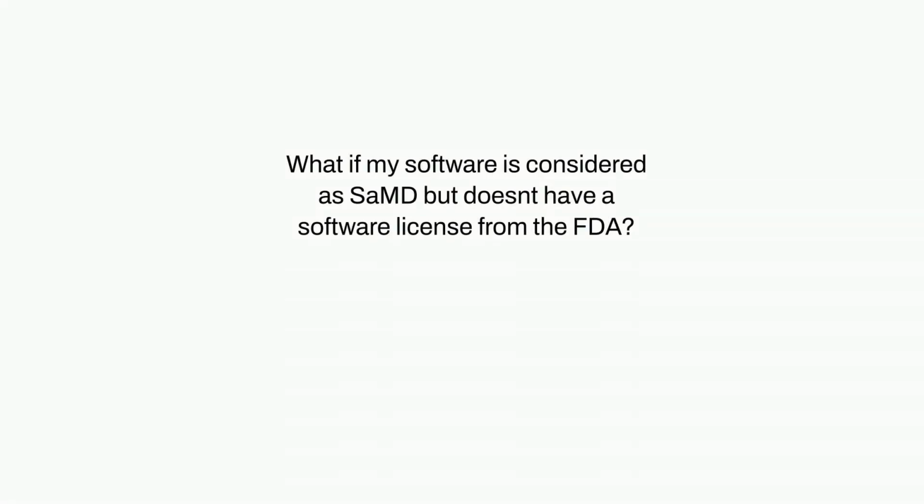If your SaMD is without an FDA license, stop selling it now to avoid legal consequences. Speak with the FDA to determine if there is a grace period before enforcement. SaMD is seen as a medical device, so FDA authorization is necessary for customary clinical use. Submit a PMA application with details about device creation and security. FDA will examine these details for approval.